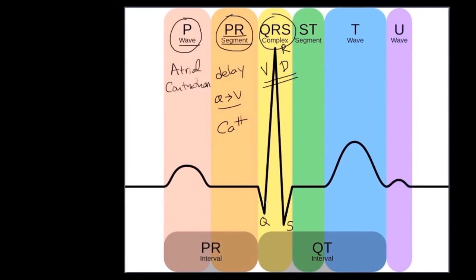But at the same time that this is occurring, the atria, which depolarized way over here during the P and the PR interval, are now repolarizing. Now remember what that looks like. You've got cells where sodium has come in very quickly, and that's given a positive charge. What's now occurring is there's repolarization. Basically, that is accomplished by potassium leaving.